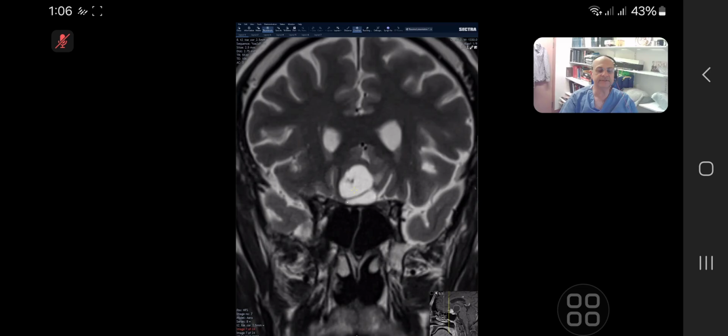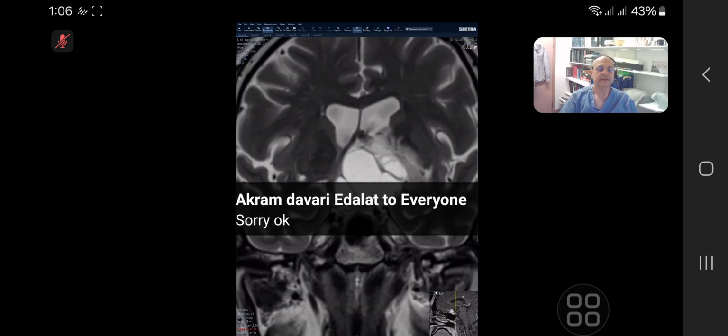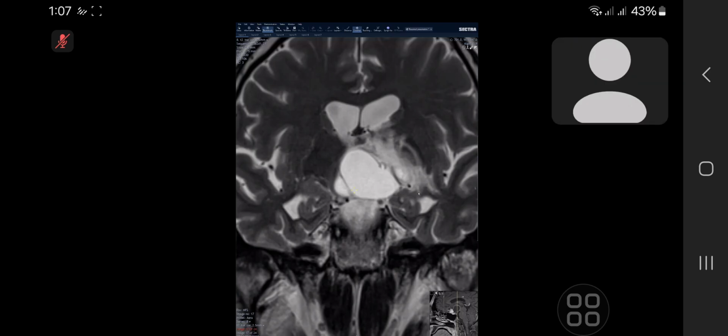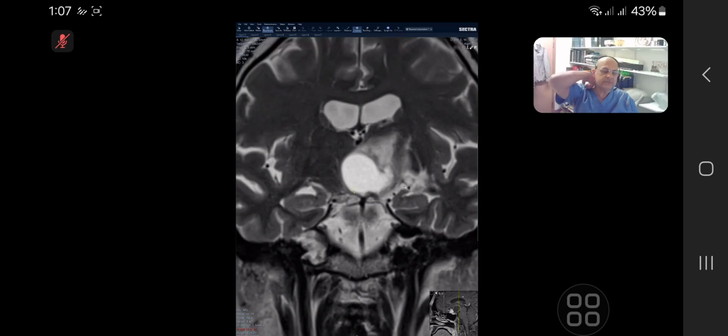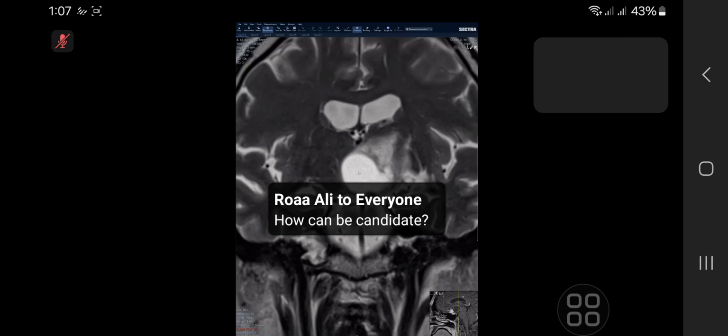There is a cystic part which is touching, but the main epicenter of the tumor is in the suprasellar region. And it is causing edema in the left basal ganglia and medial aspect. So by virtue of location, and this being a young-looking patient scan, solid and cystic, what becomes your main diagnosis? Craniopharyngioma. Correct. Well done. That is how it works.